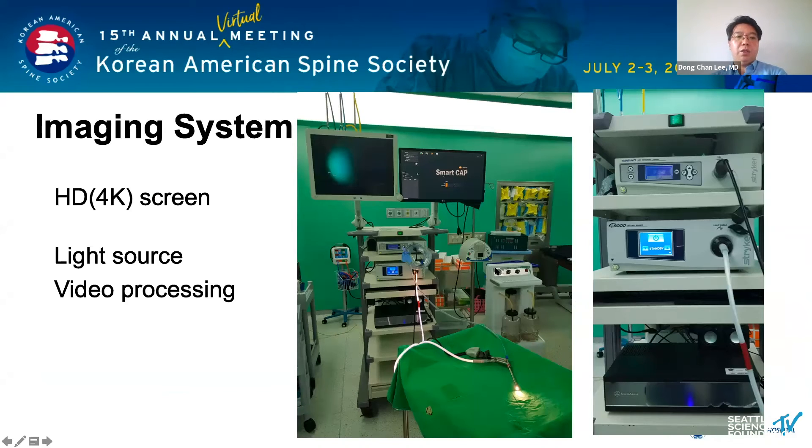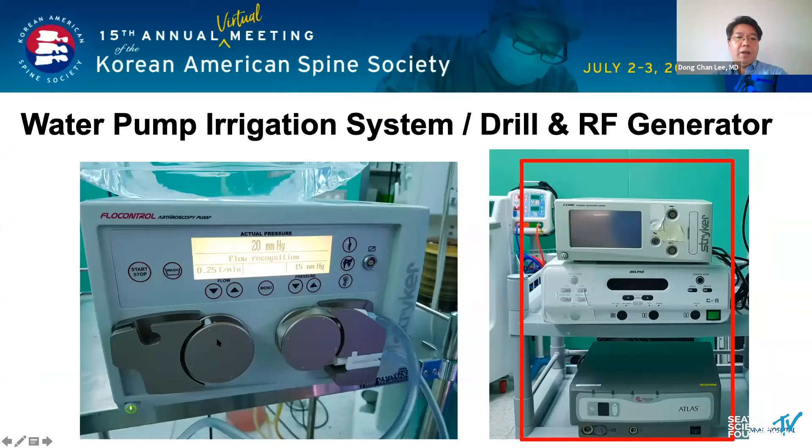This photo shows the imaging system. The imaging tower consists of an HD screen, light source, and video processing. I usually use the continuous irrigation system. Initially, it is set to a flow of 0.25 L per minute and a pressure of 15 mmHg. If the vision is poor due to bleeding, the pressure can be increased to 25 mmHg.